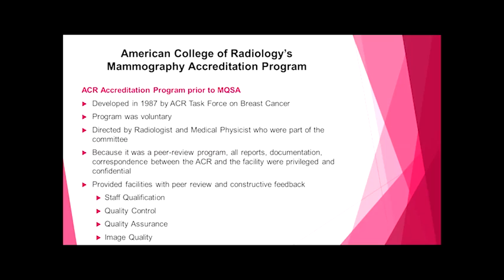Within the ACR, the program was directed and implemented by radiologists and medical physicists who were part of a committee within the ACR. And they saw what I think is one of the greatest advantages of this program.